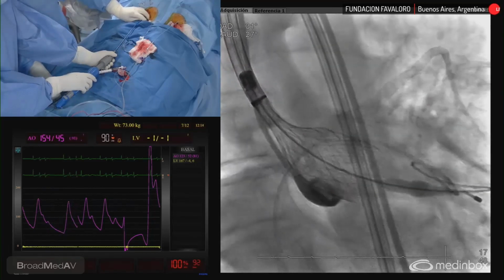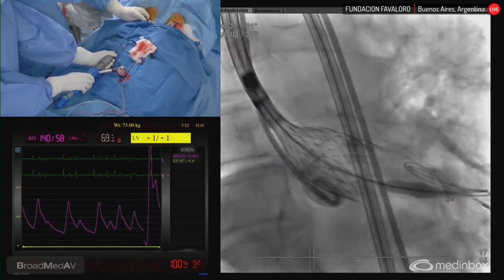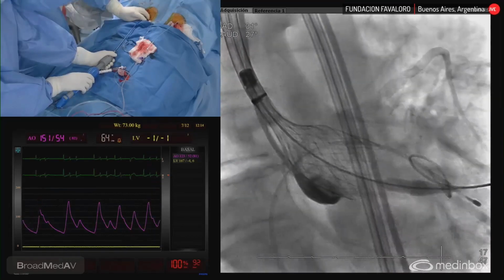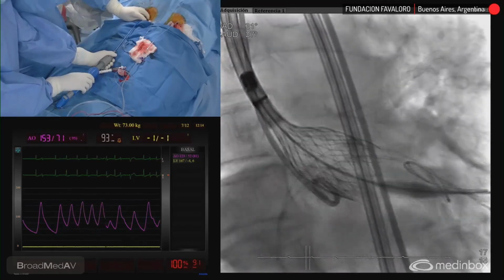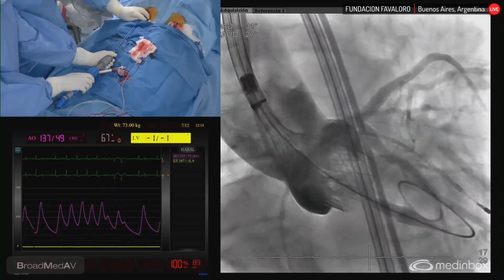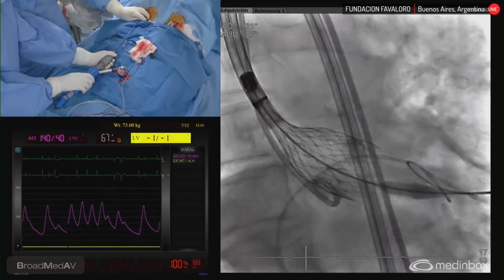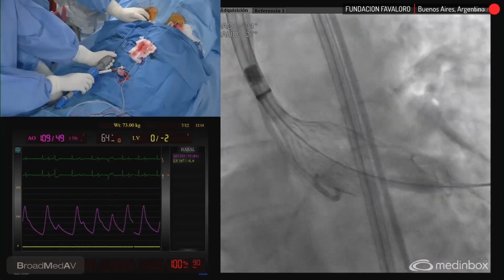Yeah, I think so. And you see that despite the angulation of the annulus, the valve is very well positioned in the center. I wouldn't say against the external wall, but in the center, which is okay. Hopefully there will not be too much movement after the final delivery. Let's check on the left oblique view.